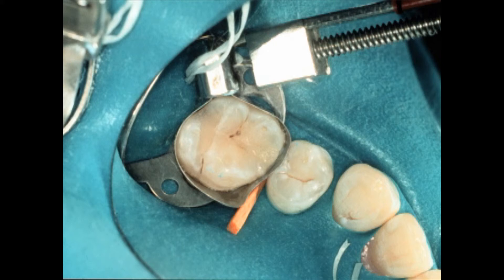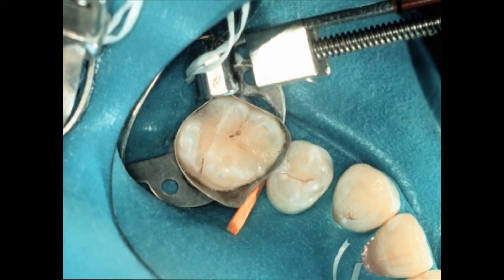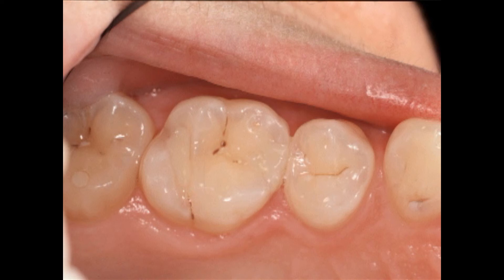This is untouched — you can see there's no debris around here. Take a look at this rounded marginal ridge and the subtle enamel irregularities that make that margin look real. I challenge you to do this freehand with no extra time or effort involved in shaping, finishing, or contouring. When I put the composite in, it was sticking out like a teepee — now it looks like a beautiful marginal ridge. Immediately after removing the dam the tooth looks a little light because it's dehydrated, but a day or two later it's nearly invisible. With very little effort, you save time, you save materials, you save the patient's time — everybody wins.